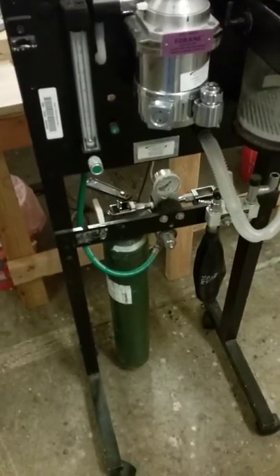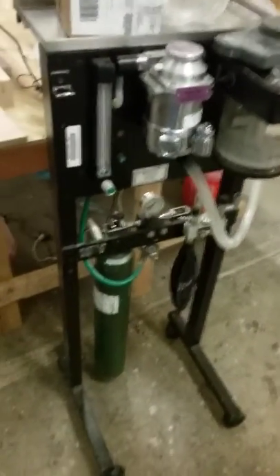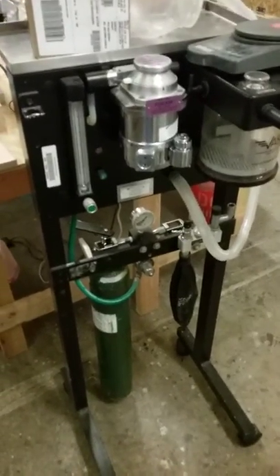Even when the oxygen cylinder is in the red zone, you still probably have a good hour or so of oxygen left. I'll leave instructions on where to take the empty cylinders to get replacements, but three tanks for a week should do — good luck!